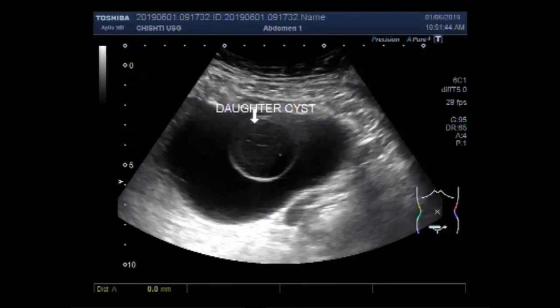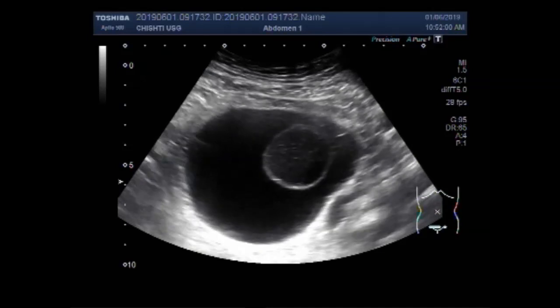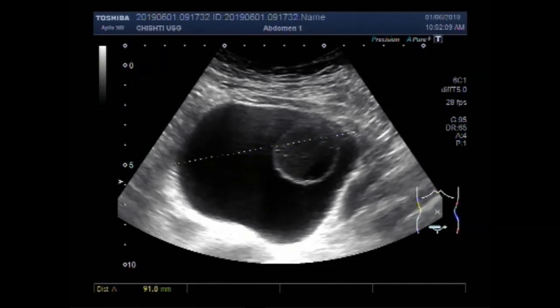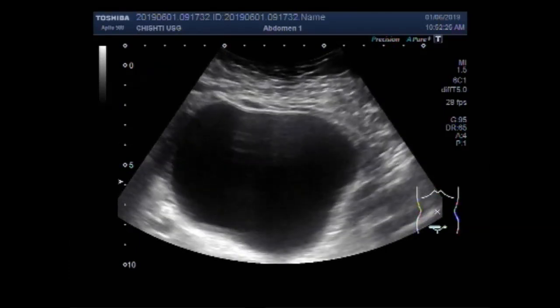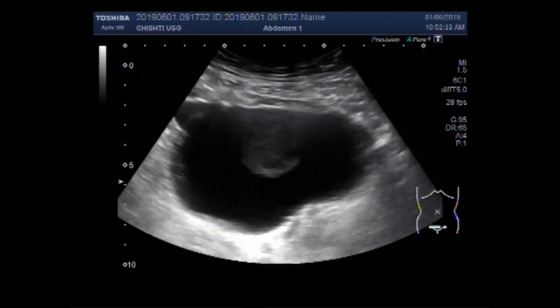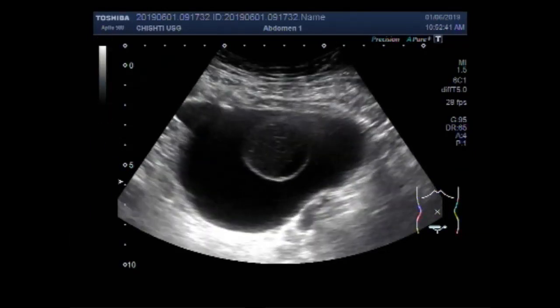So this is a hemorrhagic ovarian cyst — this daughter cyst — and it measures about 3.4 cm by 3.3 cm. The large ovarian cyst measures about 9.2 cm by 7.3 cm. Quite a large ovarian cyst. No blood flow is seen inside the cyst.